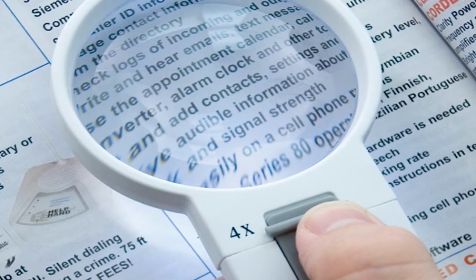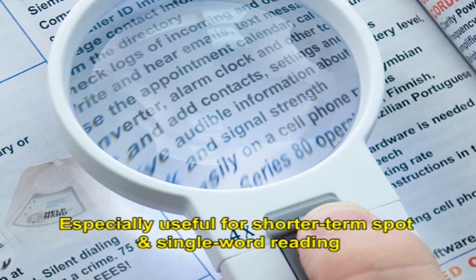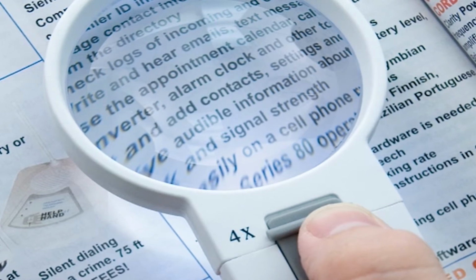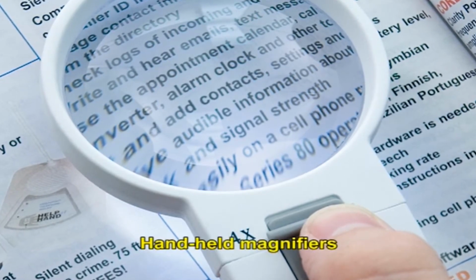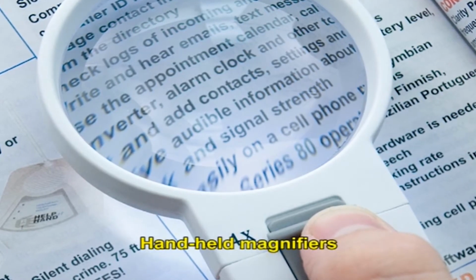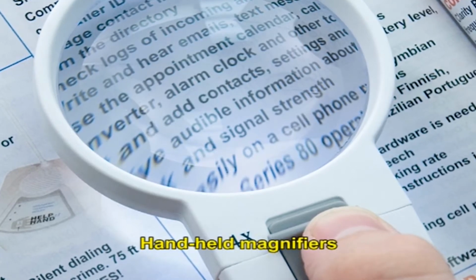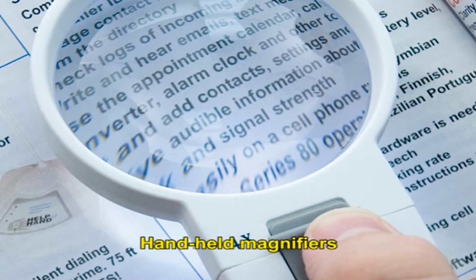The handheld magnifier is especially useful for shorter term spot and single word reading, such as looking up numbers in a telephone book or reading price tags. Handheld magnifiers are one of the simplest types of magnifiers to use and are also the most familiar. Nearly everyone has used a handheld magnifier at some point in time.